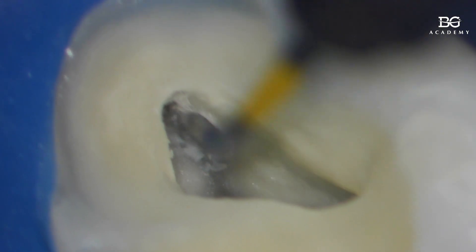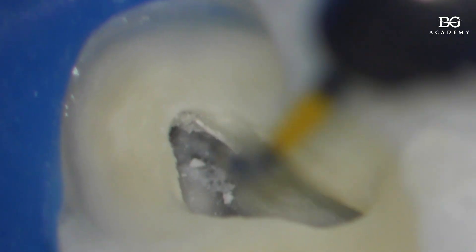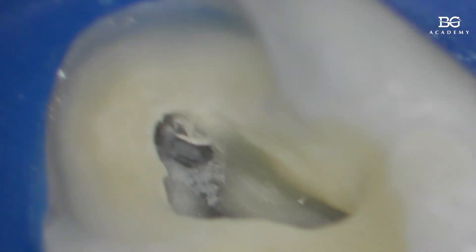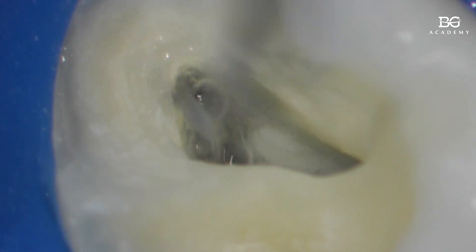Right now we're not working downward. The main work with ultrasound in this case is directed mesially, and a bit towards the buccal side — like this. If we're working with ultrasound without cooling, without water, it's literally just 10 to 15 seconds, then we rinse, dry, and wait.